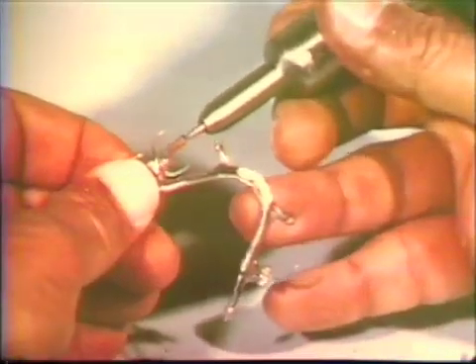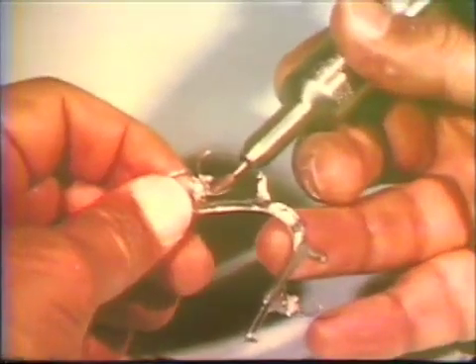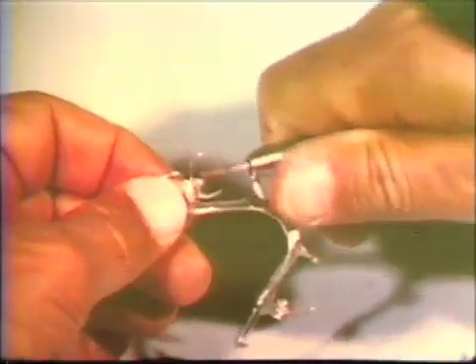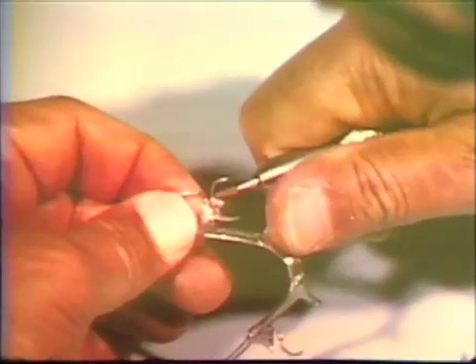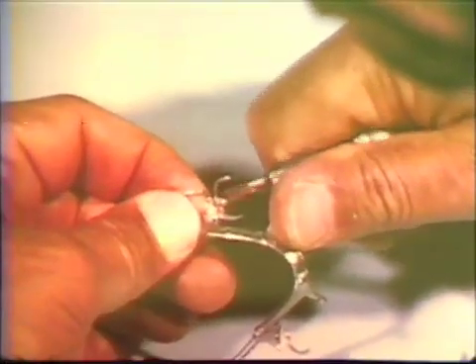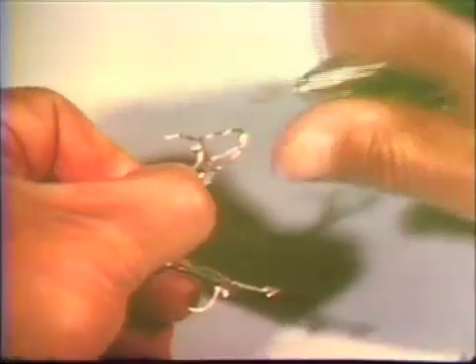The tissue contacting surfaces of the occlusal rests and the reciprocal arms of the direct retainers should not be reduced. However, any flash of metal beyond the rest preparation is removed and the polished surface sculptured.